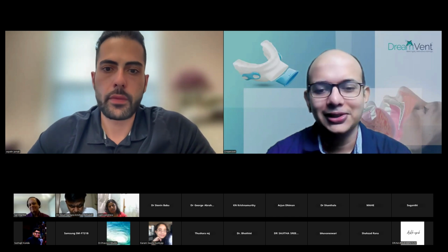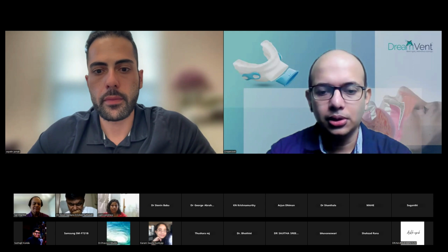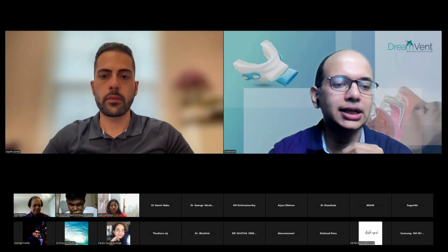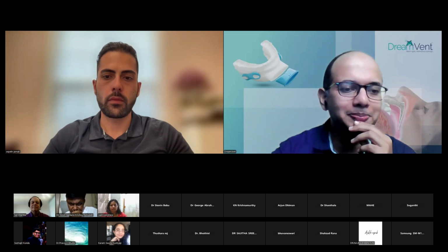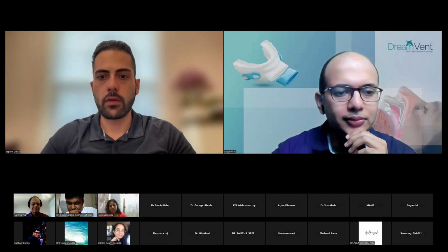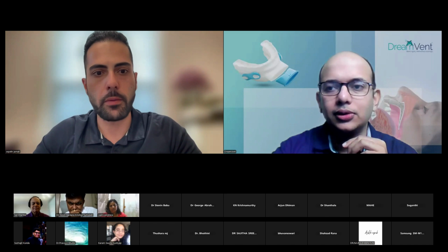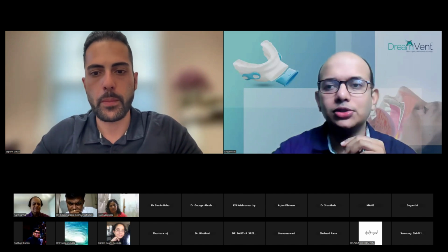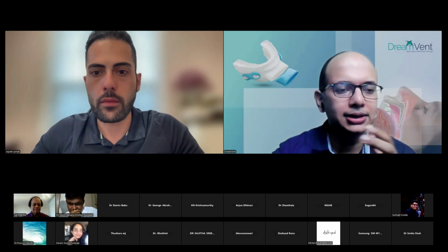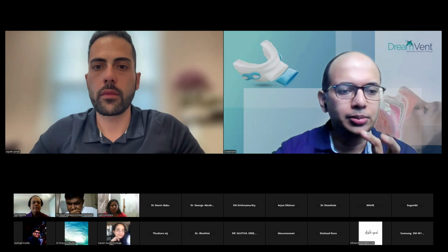So, right. We have another question from Dr. Gauri Shankar: can this be used in case of OSA in pregnancy? Yeah, I don't see any contraindication for pregnant women to wear the appliance. Definitely. Okay, so there's no contraindication in using this for pregnancy. Dr. Sat, anything that you'd like to add regarding OSA in pregnancy?